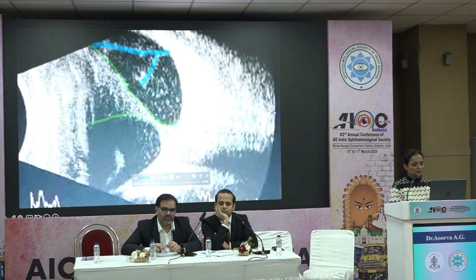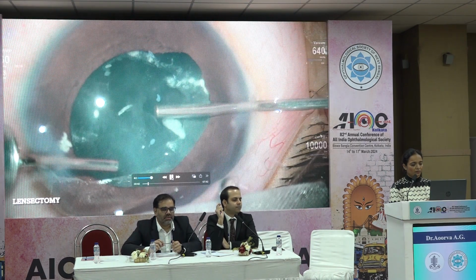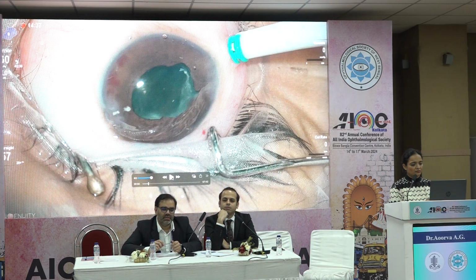One second. You want the B scan or the entry? When you were about to make your entry... Okay, one second. Yeah, there. Okay.